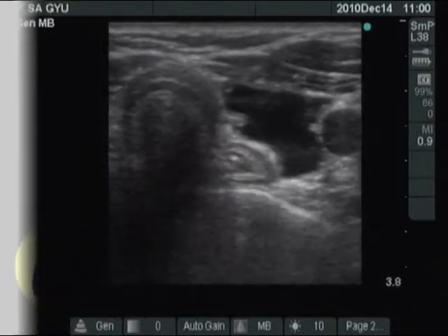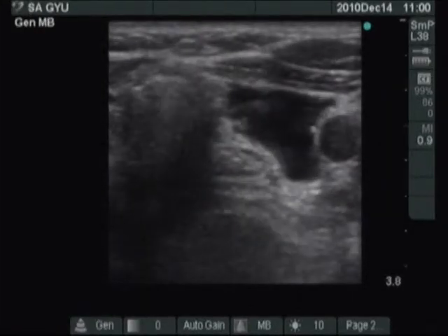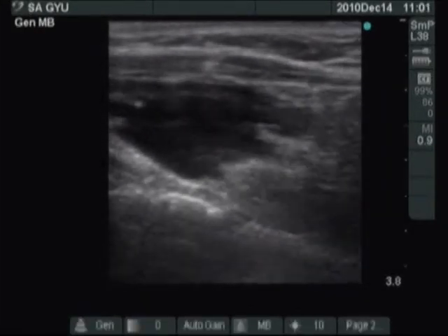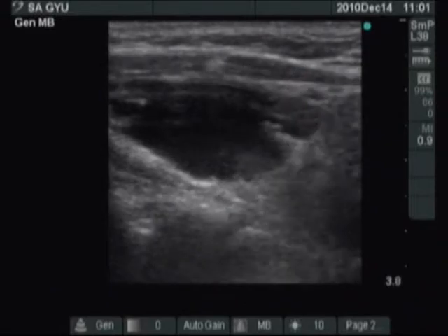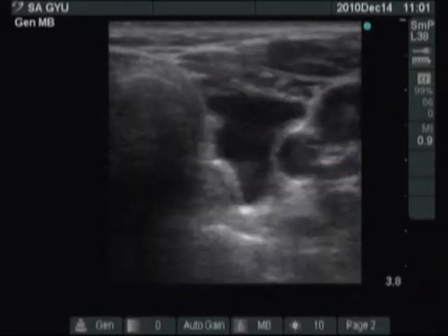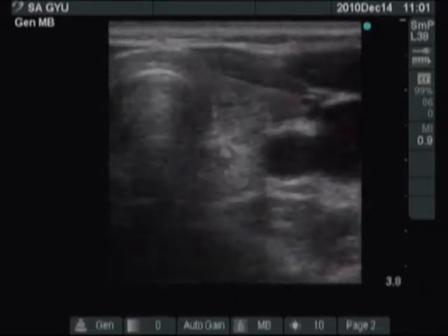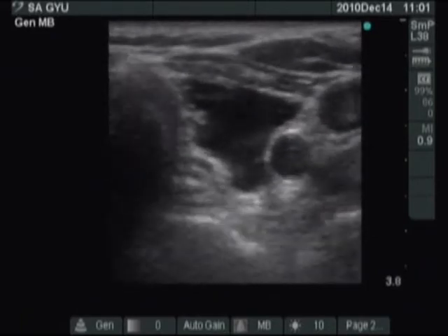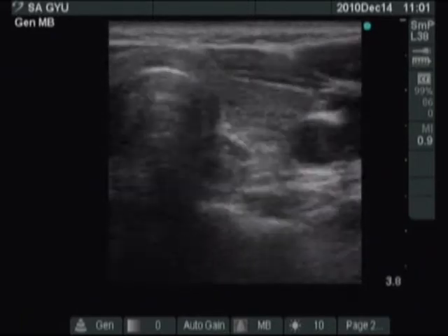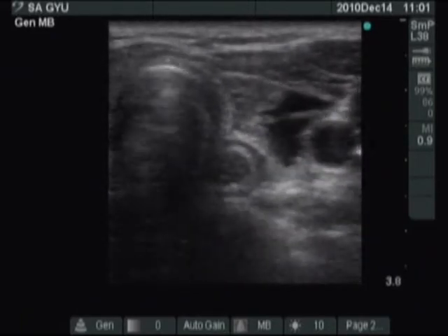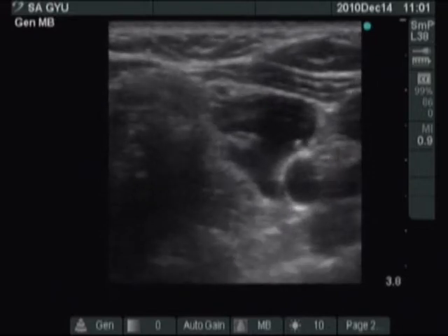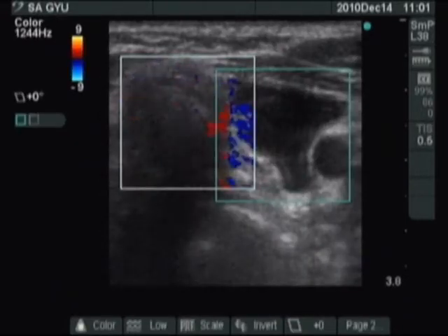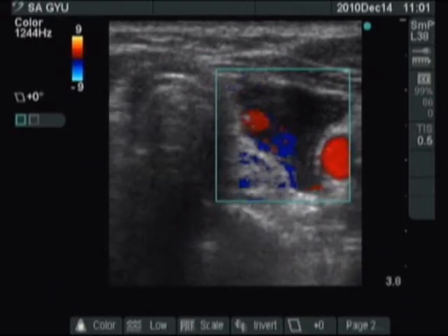We demonstrate the first session of the sclerotherapy of a parathyroid cyst. The left lower parathyroid was cystically degenerated. The lesion was found beneath and dorsal to the lower pole of the left lobe. The lesion was very close to the carotid artery, so we had to be very careful during the procedure. The vascularization is not specific.